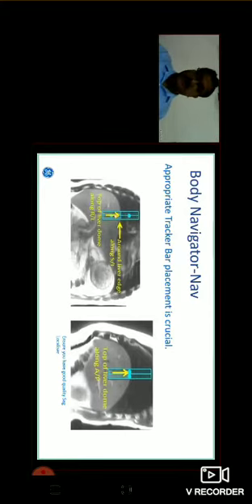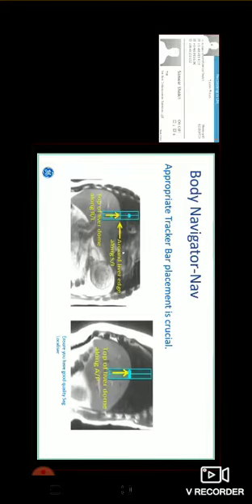Don't worry, the navigator placement is perfect. Just right click. You have an option. Select the navigator. Just submit. And from the toolbar, three clicks. The navigator is placed.